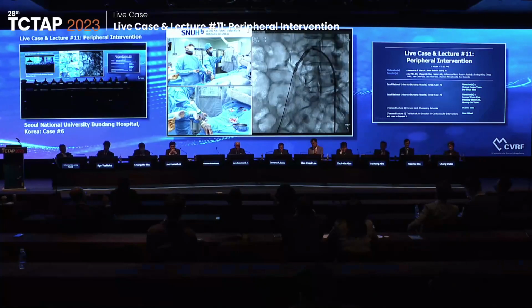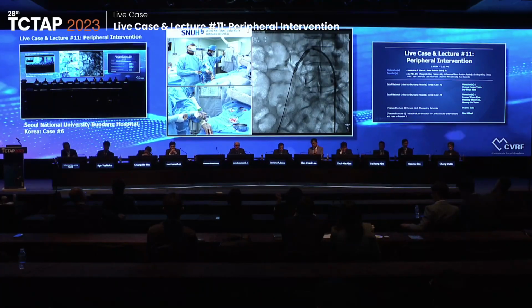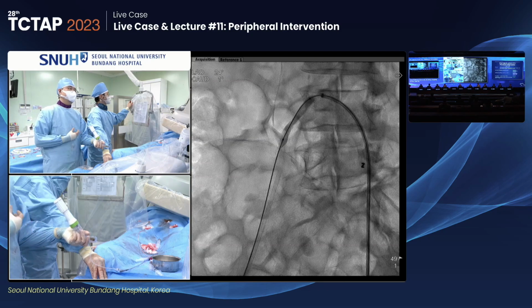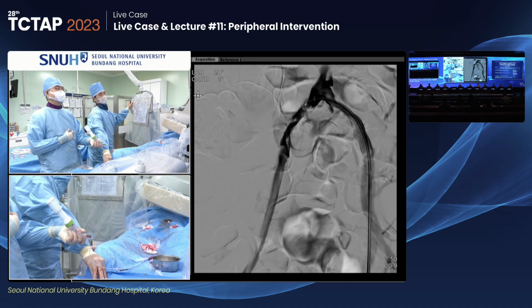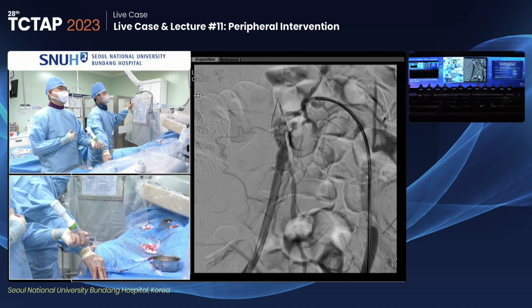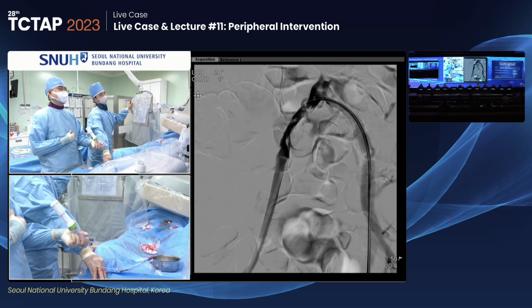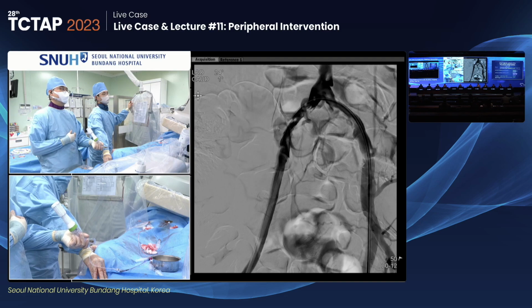As I told you, I inflated the balloon with an 8mm balloon. And then the patient felt some pain at his lumbar, back area. So I just stopped the balloon at 4 ATM. And then this is the angiography just after the balloon angioplasty. You can find there is a plaque and then dissection. And I was not sure the distal reentry space is below the bifurcation area.